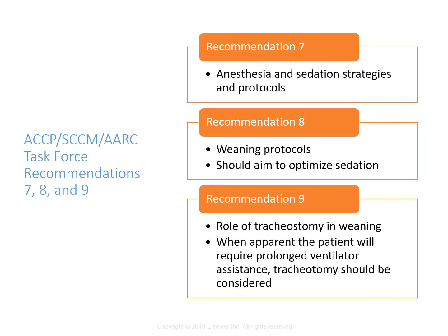Recommendation 7 states that the anesthesia and sedation strategies and the ventilator management should be aimed at early extubation in postoperative patients. So as soon as we can get them off and safely do so, right? A depressed respiratory drive and pain are the main reasons for their vent dependence. So a lower anesthetic sedation regimen may help them get an earlier extubation as well.